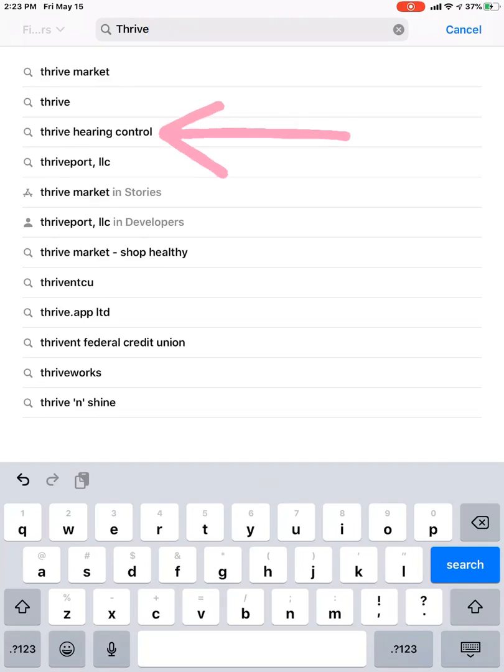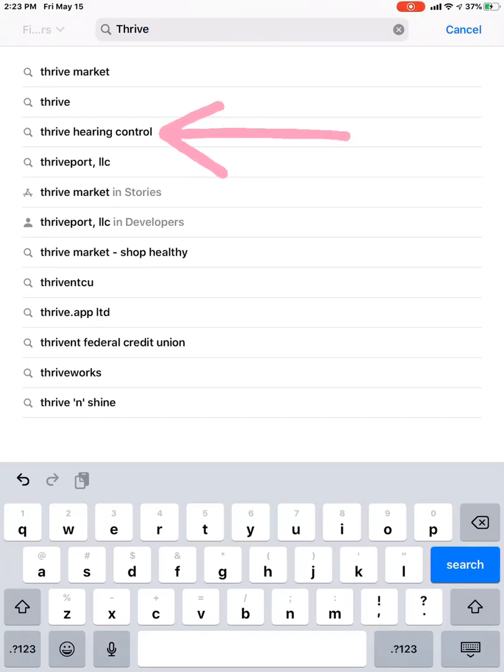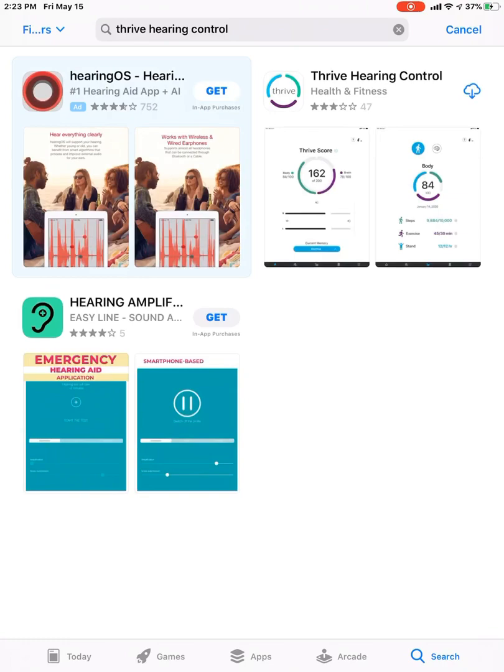It's the third one from the bottom. So it'll be Thrive hearing control. You can either finish typing it out if you don't already have it popping up. I'm just going to tap there on that list, the third one from the bottom, Thrive hearing control.